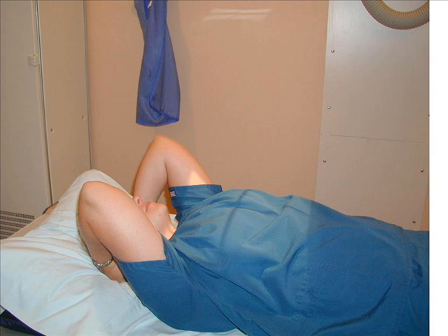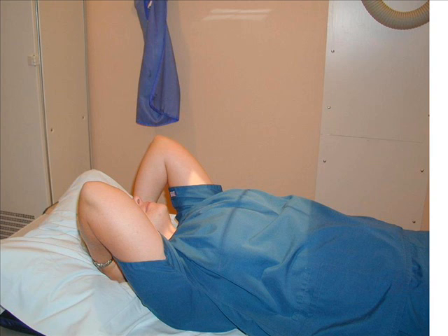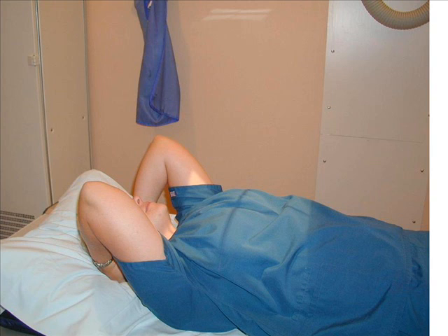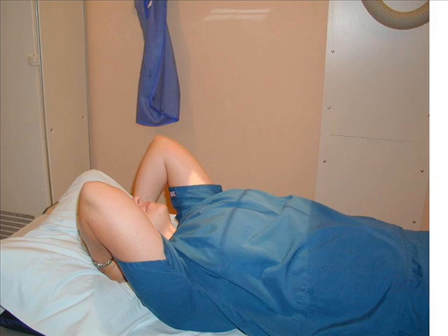Rest the patient's hands under their head to rotate the scapula away from the ribcage and free the axillary region. The central ray is directed at the level of T7. Suspend respiration on full inspiration to depress the diaphragm as much as possible.